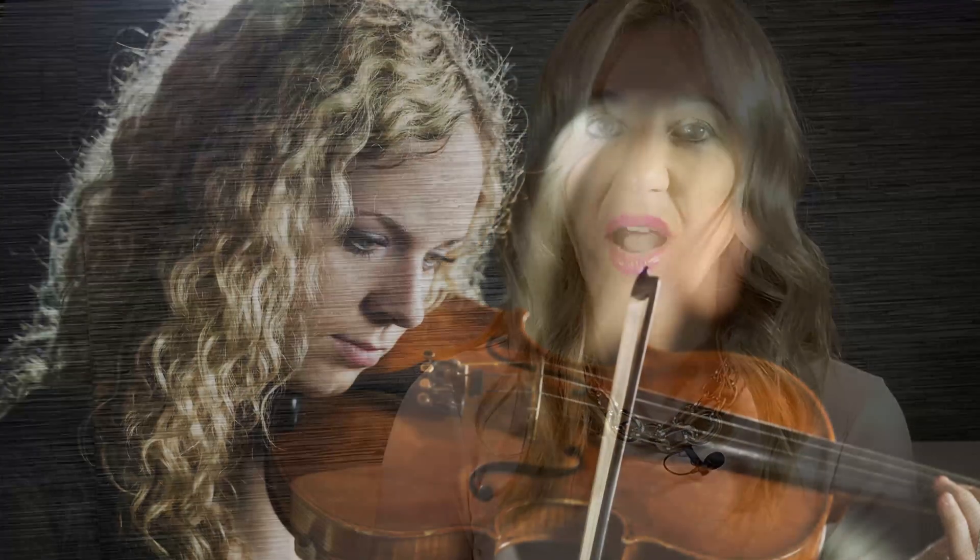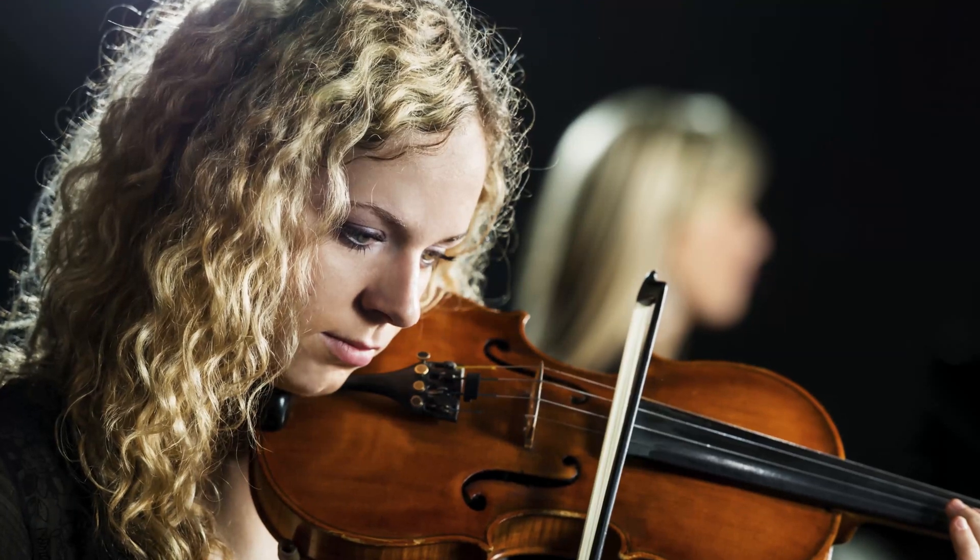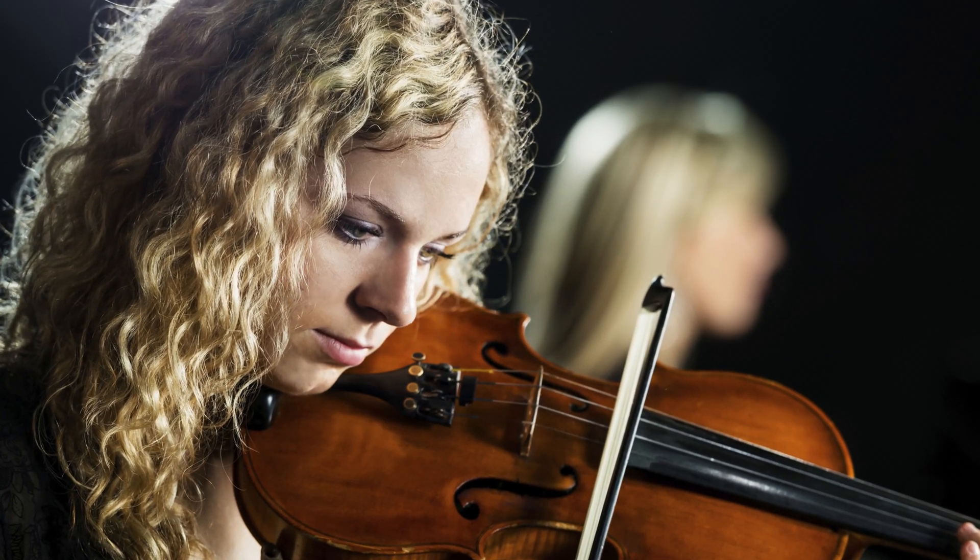The musician earplugs have a filter inside them. There are three different filters you can get, which will vary the amount of attenuation of the outside noise. This will give you the best sound quality because the filters evenly attenuate the sound. This is ideal for listening to music and for professional musicians and singers.